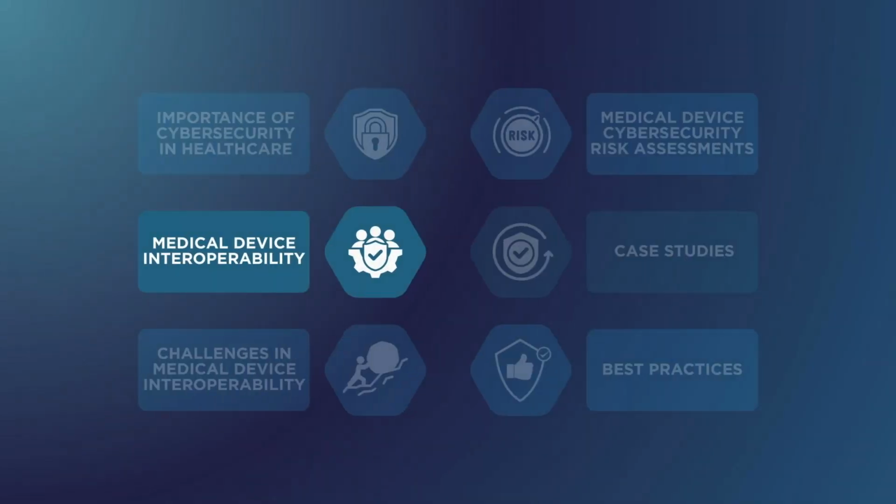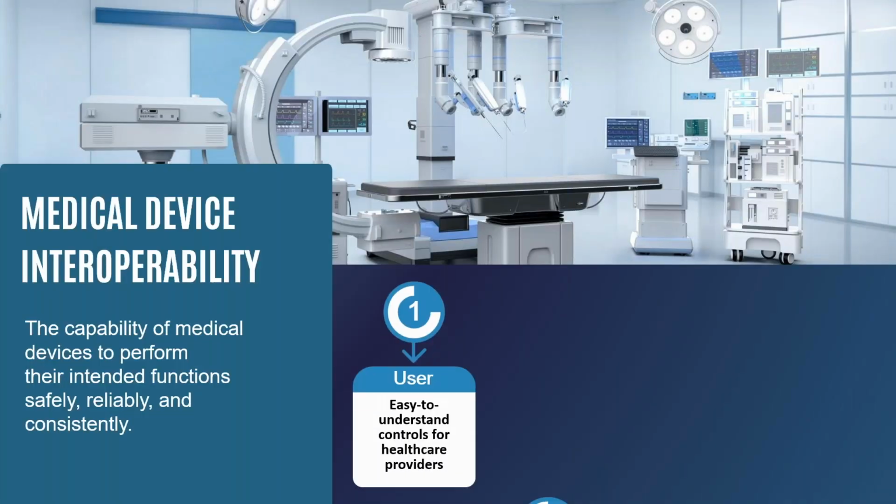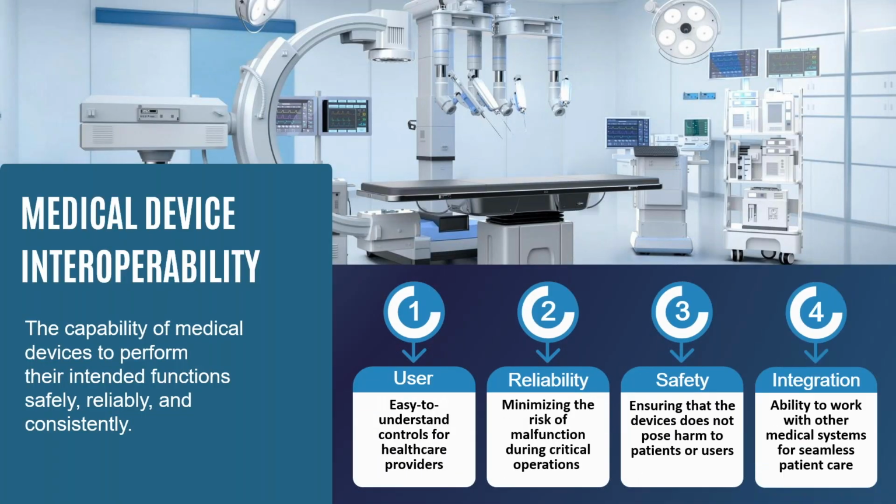Next up, medical device interoperability. So there are 4 key principles to bear in mind when assessing new medical devices for interoperability into your system: the users, the reliability, the safety, and the integration. So being able to use the device reliably reduces complications in training and complications in handover.